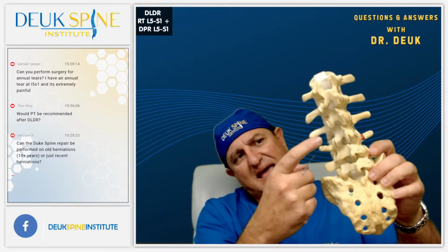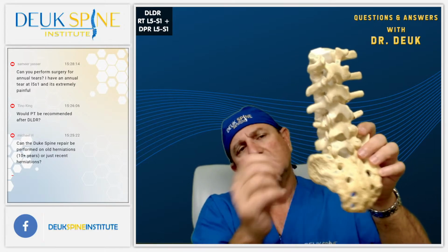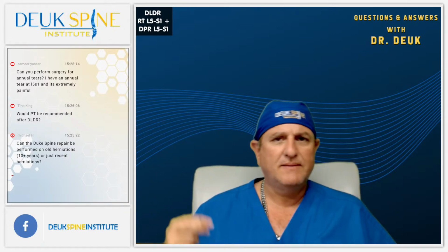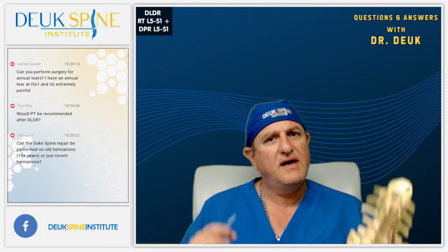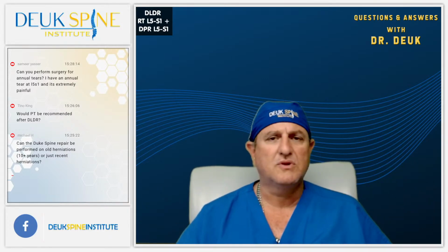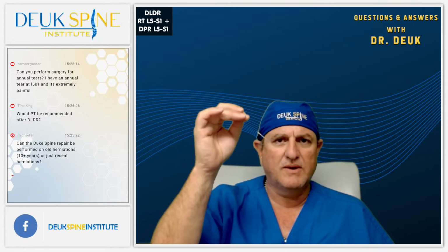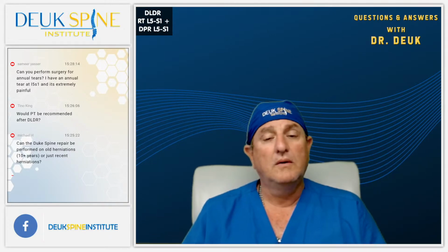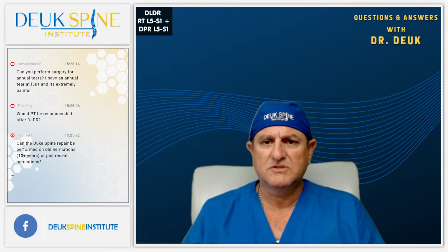Now, the nerve is exiting this hole right above the disc, right above it, right there. So as long as I get the needle in properly, and I stay low in the foramen, I keep the patient awake, I get their feedback, oh, it hurts down my leg. If I hear that, I gotta stop, back up, restart. That means that I'm too close to the nerve. So once I get that needle in perfect position, which I do right away, then the rest of the surgery, I'm not really worried about the nerve at all. If you don't do it this way, then you better worry about the nerve constantly.